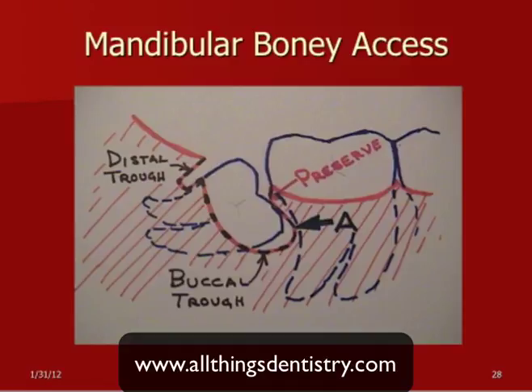Now this is an artist's rendition. It's highly exaggerated, of course, but this is what I'm talking about here. There's a big gap in the concavity right underneath the second molar. So you want to do your buccal trough here. One of the keys to extracting a tooth is that you've got to get pressure on this mesiobuccal line angle. So you want to get down there as deep as you can.